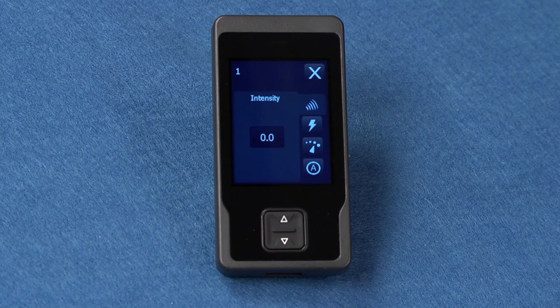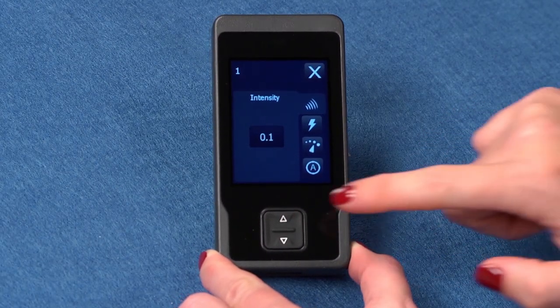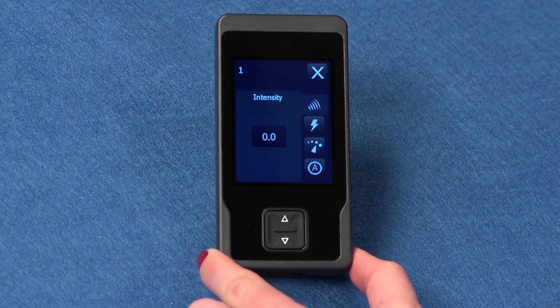The available settings for the selected program will display. Use the increase-decrease keys to adjust desired program settings. You should be aware that some settings may not be available depending on what your clinician has programmed for your neurostimulator.